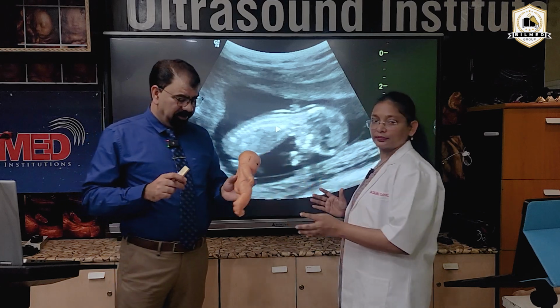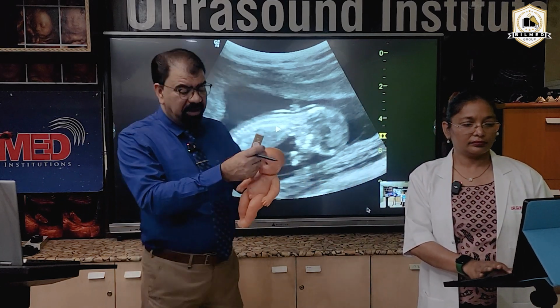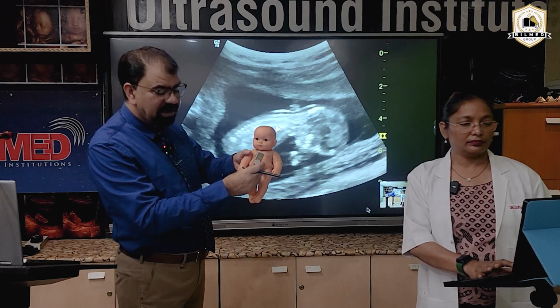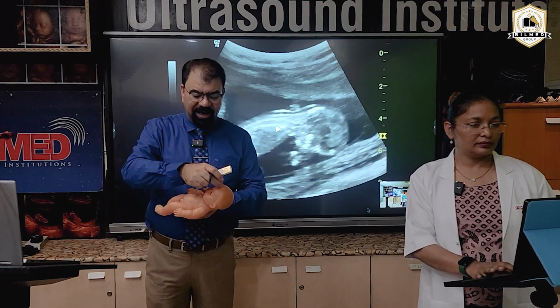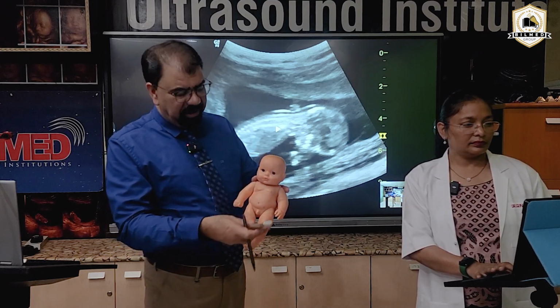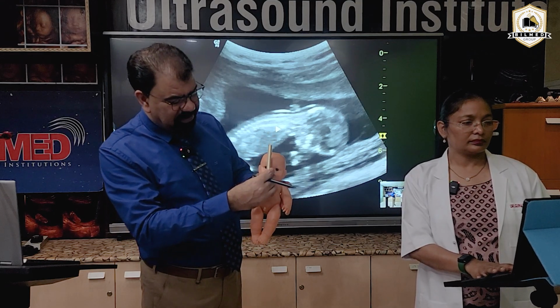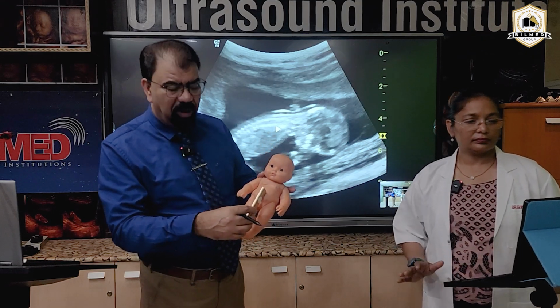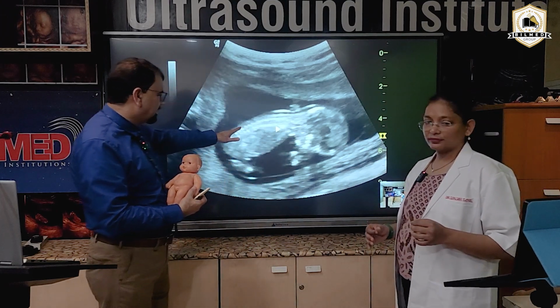So the basic important point is that the fetal section has to be a complete mid-sagittal section. The fetus has to be in length. If your beam is cutting a mid-sagittal section from this fetus, the image will be like this over here.